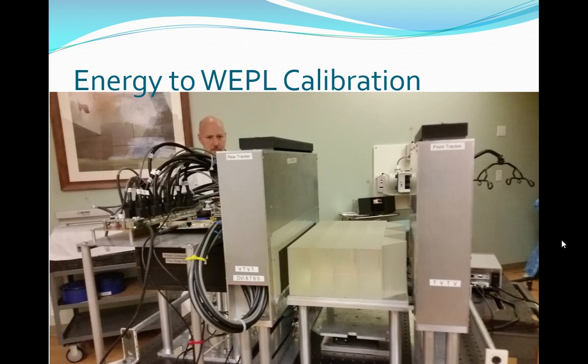You can see the T and V planes marked out. You can see they're reversed on here, and there's your energy detector. This one is being set up at the Chicago center because he's their medical physicist who is working with us on this. In any case, that's kind of setting up that room when it goes in.